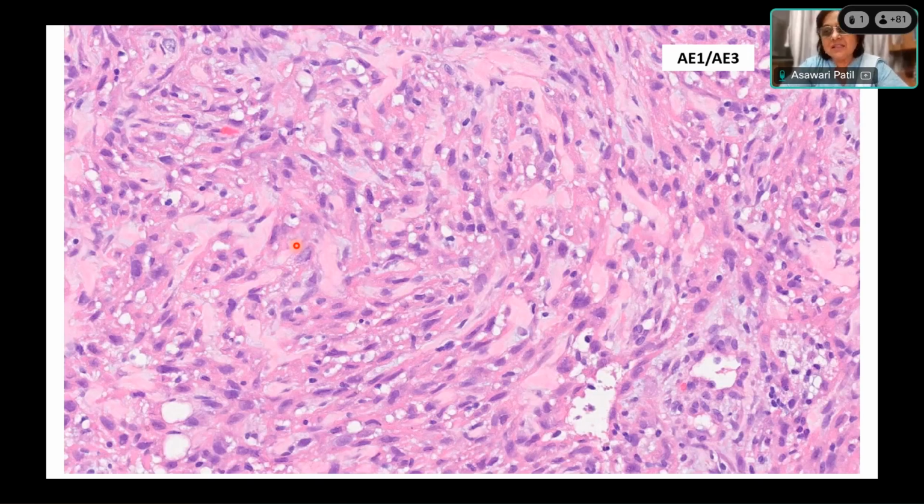Now, is there any IHC that would help you? Will you do any IHC on core biopsy? And if you want to do, what IHC?